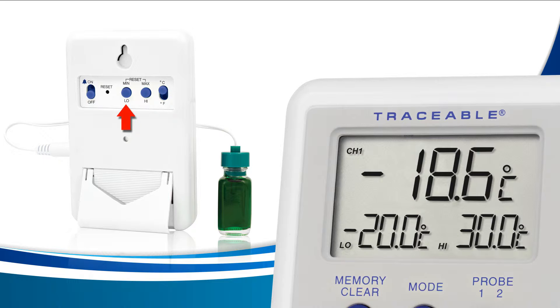Each press of the low button or the high button will increase your current low or high alarm by a tenth of a degree. If you'd like to increase your values faster, holding either button down will rapidly increase the digits.